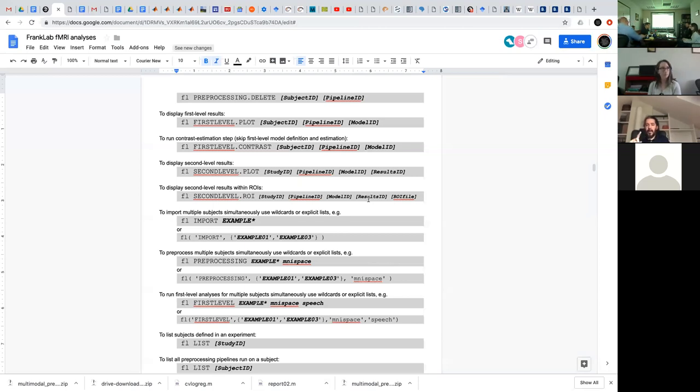Okay, and there was another question related to the aggregation that I wanted to ask you guys, because there is still no option for this, and I think it might be actually useful to have that additional option, but I'm not sure how to put it. So when you specify an ROI file, we are always thinking of these ROI files as basically ones and zeros, right?